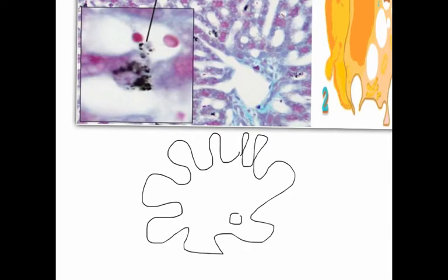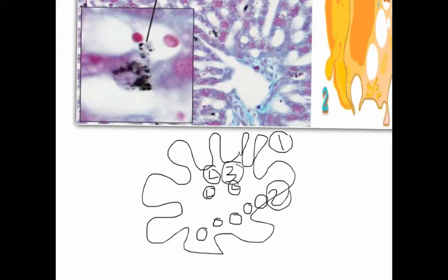After that, we have a lot of phagocytosed particles inside this cell, in addition to lysosomes of different types. We have a lot of lysosomes of the different types you have studied in the cytology, in addition, of course, to the residual bodies, which are one of the types of the secondary lysosomes. Also, these are very important features: the folds, the phagocytosed particles, and the different types of the lysosomes. Also, you can see the Golgi apparatus, in addition to the normal organelles such as the rough endoplasmic reticulum.